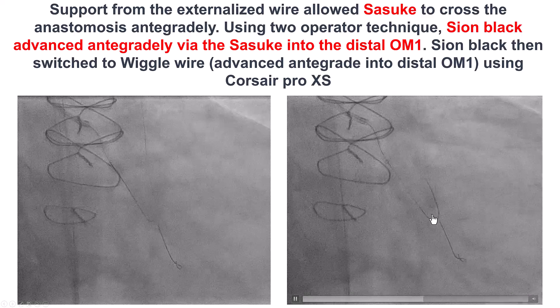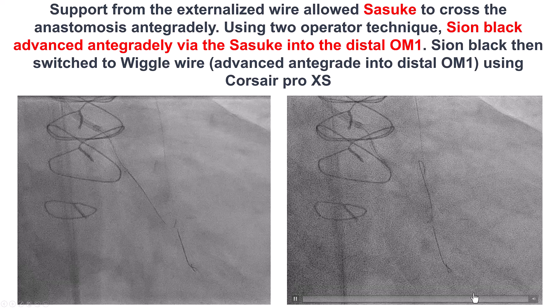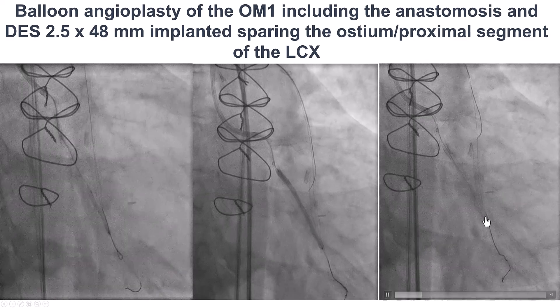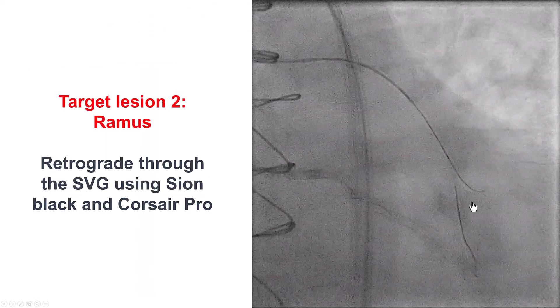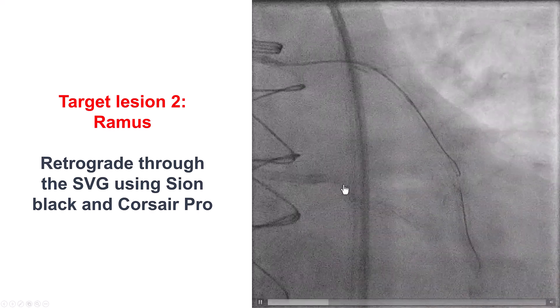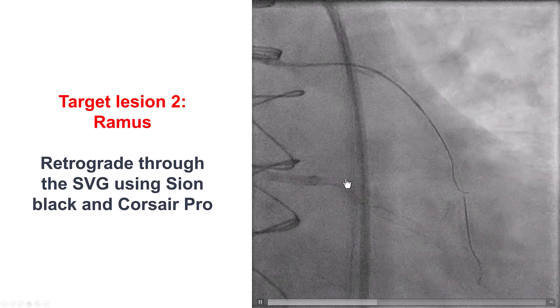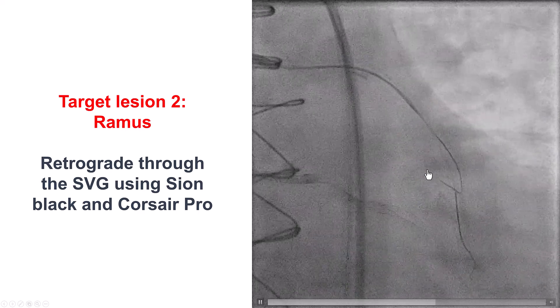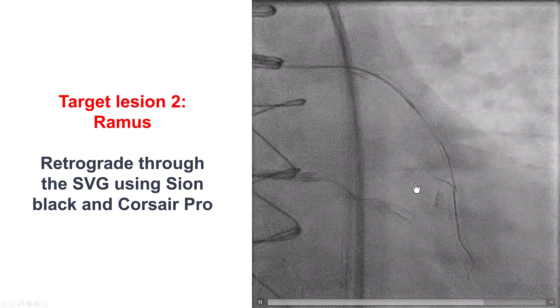That was an interesting approach — first retrograde and then antegrade with a dual-lumen microcatheter to wire into the distal vessel. We ballooned the obtuse marginal branch; crossing through the anastomosis area was not easy but was achieved after multiple predilations. We then placed a stent, but before stenting into the left main, we wanted to first recanalize the RAMUS CTO, because there was a bifurcation at the proximal cap of both CTOs. As planned, we started with a primary retrograde approach.